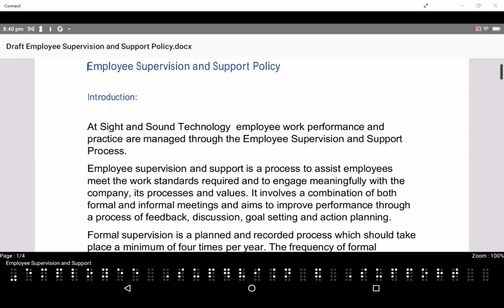So I think the word processor is very powerful for what it does, and we probably haven't explored everything, although we've explored a fair amount of the things that you might want to do. But I hope you will get a sense that whilst it's powerful, there are certain things that you may find from an efficiency perspective easier to do on a computer with an app like Word when you're putting the final tweaks to your document. So by all means, experiment with it, produce or create your document.